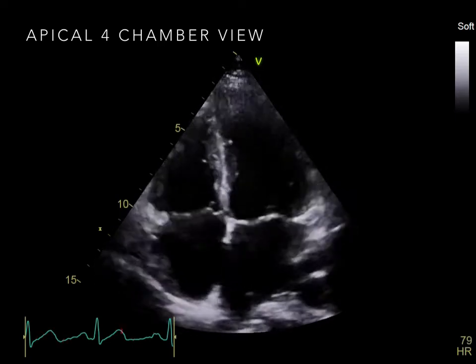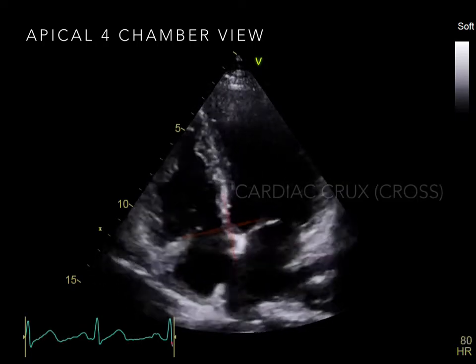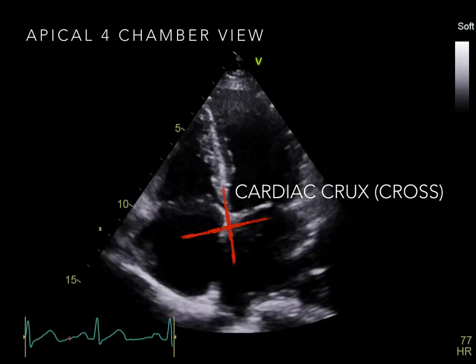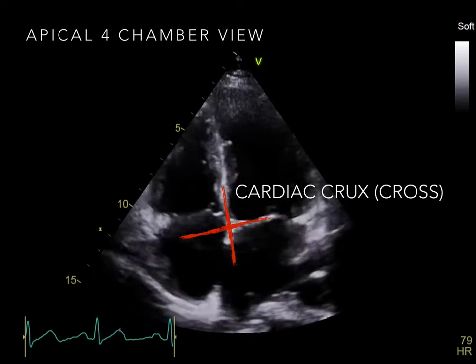The apical four-chamber view allows visualization of all cardiac chambers. The cardiac crux or cross is located in the center of the heart and is formed by parts of the interatrial septum and the interventricular septum.